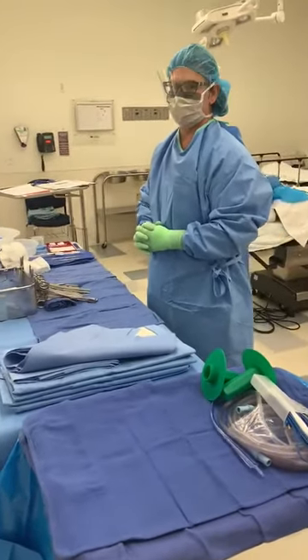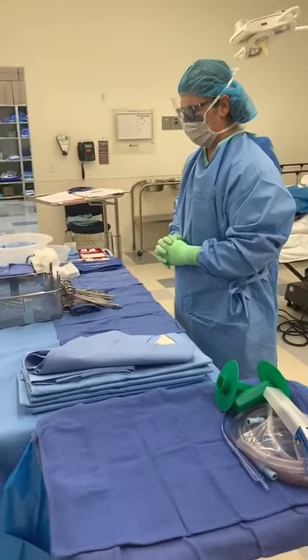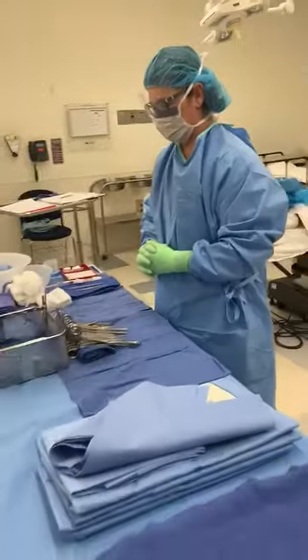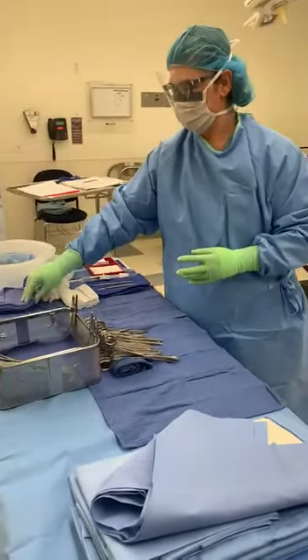Hi guys, this is competency number 12: mayo stand setup. First thing you are going to do after you've arranged and counted, you're going to set up your mayo stand. You need to create a small towel roll.